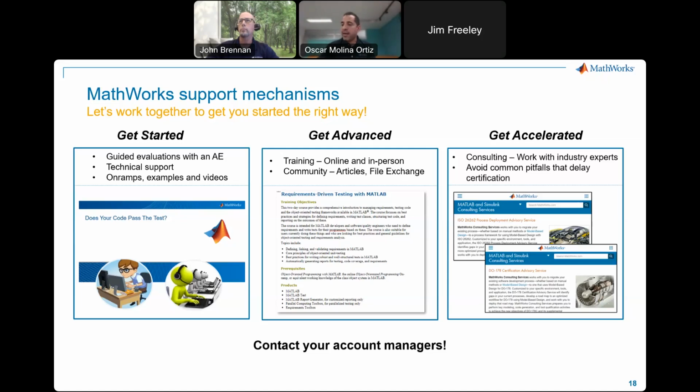I'm going to take note of that. It explains how to do app-based testing, and it's actually fun to see because your cursor is going to go places. It's going to simulate clicks, and it's going to show you what happens and so forth. But of course, this comes with a little bit of a toll on the performance side, because now you have to put the time to sit down and wait until these tests happen. And depending on your specific application, how computationally heavy it is, it takes some time for this test to run.